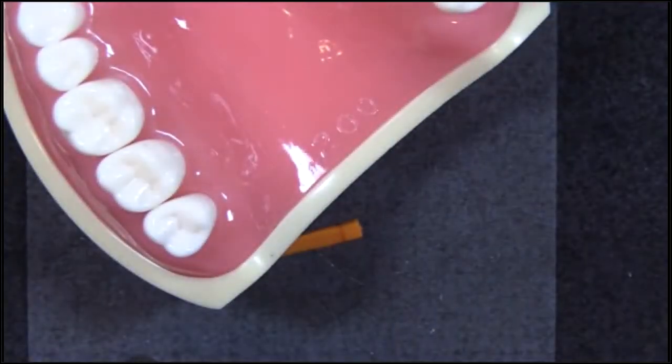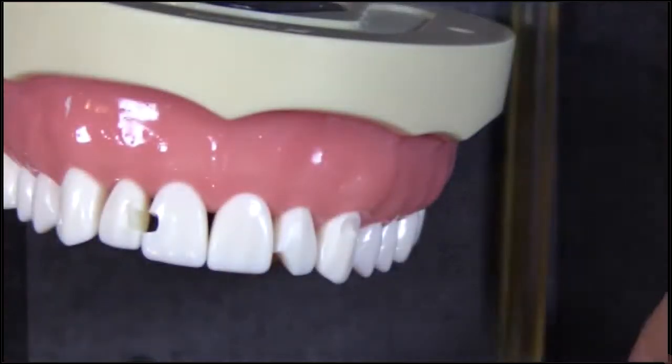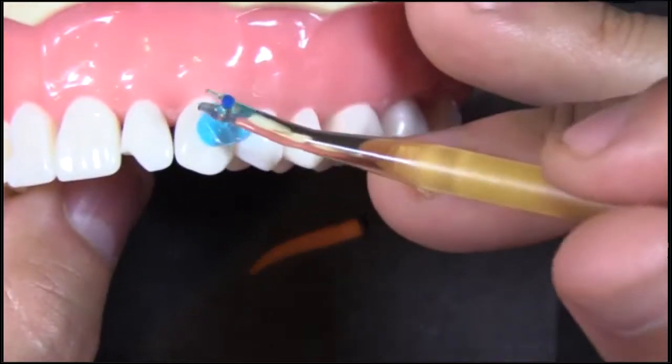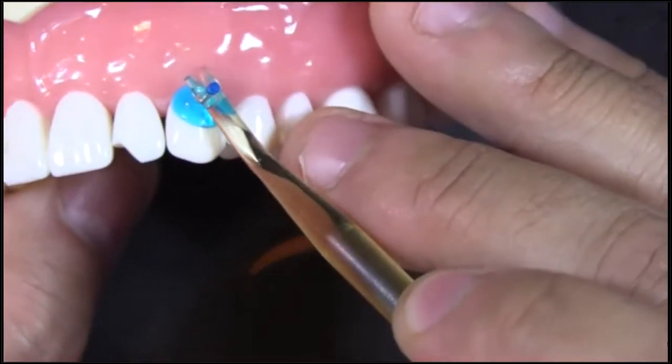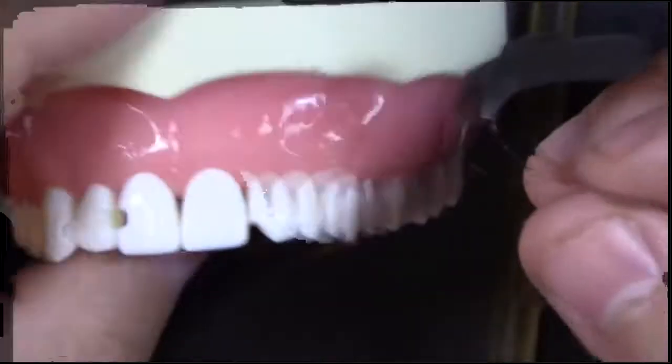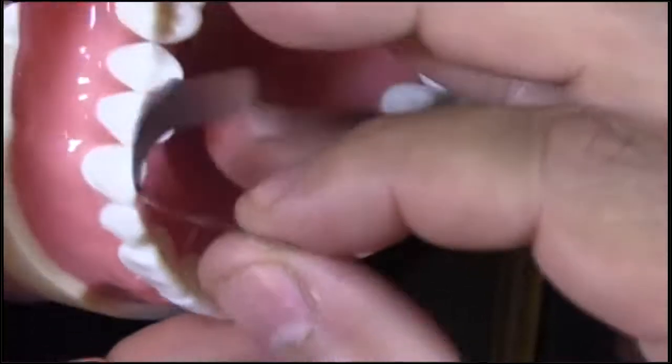So in this situation, just a normal class 5, let's say hypothetically that we had a class 3 to go along with that, and you wanted an alternative to using the fusion system with the Blue View cervical matrix. What you could do is use this. This is that Unica matrix. And the way that we can use these is essentially to tuck it into the contact.